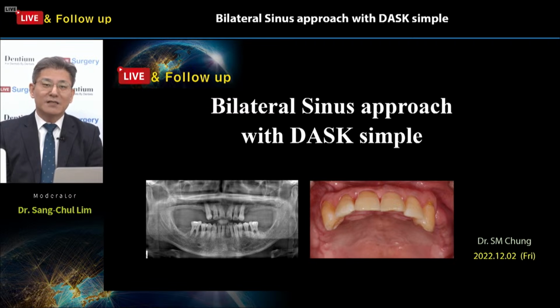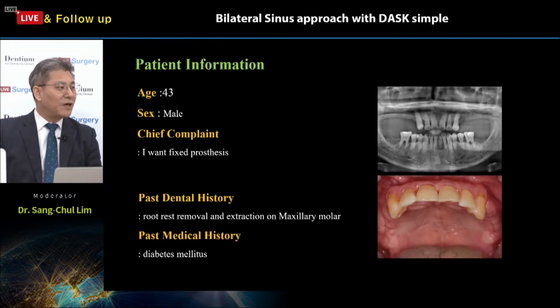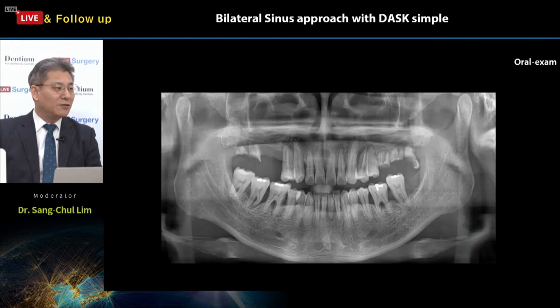Okay, let's take a look at today's case. Today's case, as I mentioned before, is a bilateral sinus approach with DASK Simple. About the patient information: the patient is a 43 year old male who wants to have a fixed prosthesis. His past dental history includes extraction of remnant root rests and periodontally compromised teeth. His past medical history is DM, diabetes mellitus.